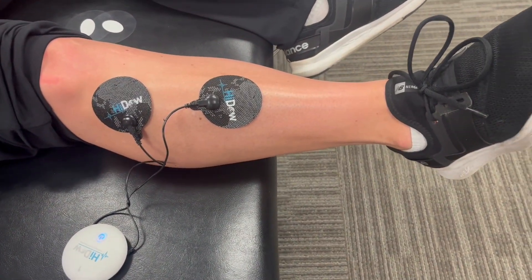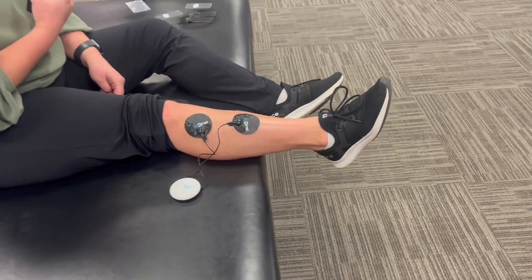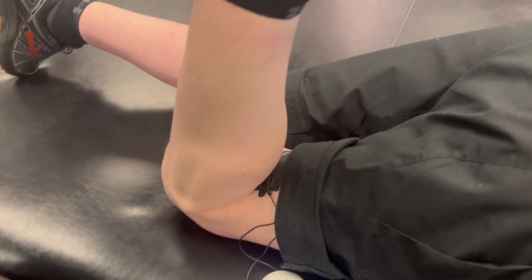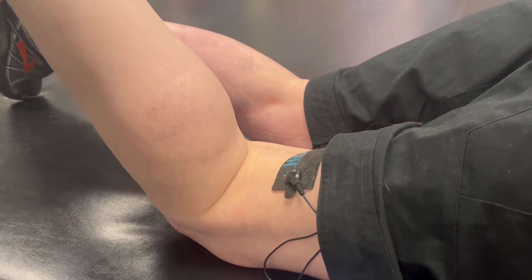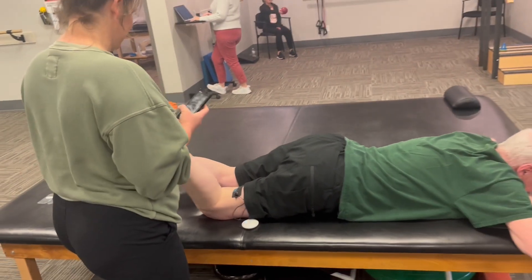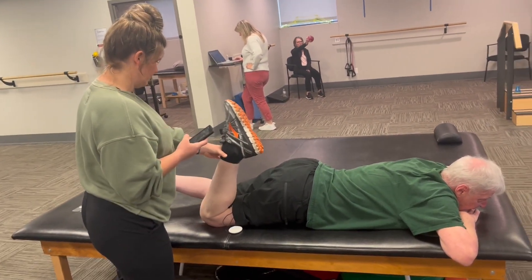This is a really useful technique after injury, or it can be used instead of functional dry needling if you don't like needles. This is also a well-researched technique for post-surgery or with neurological conditions such as post-stroke, post TBI, or with progressive neurological conditions, with the goal being to get the muscle firing.